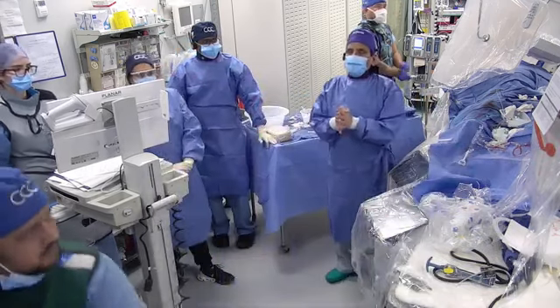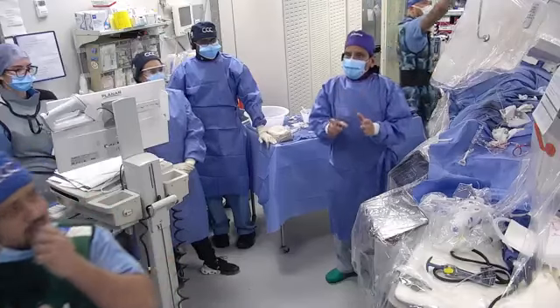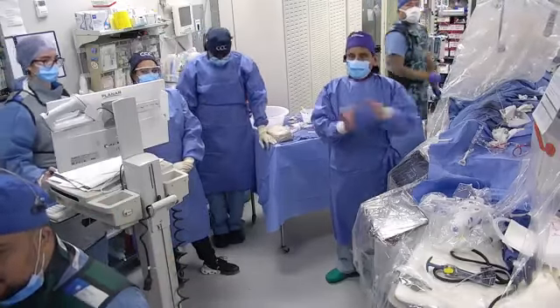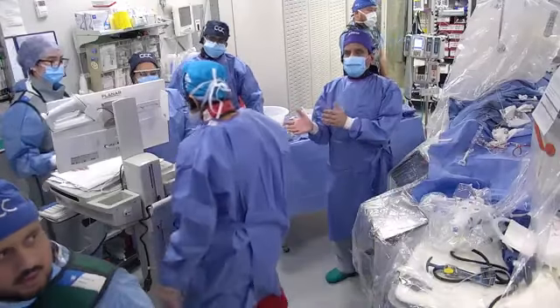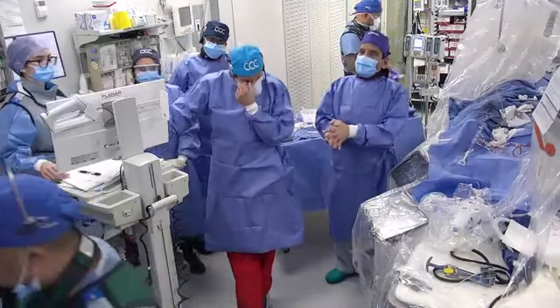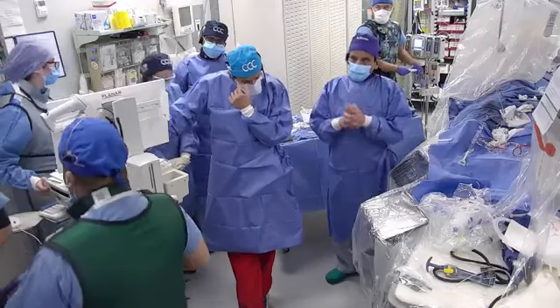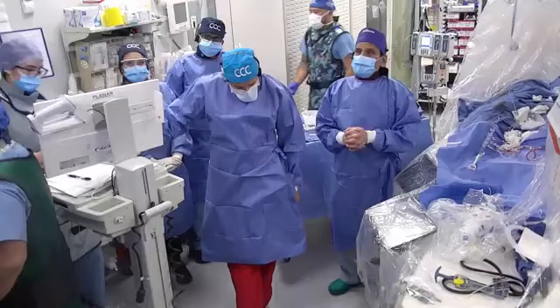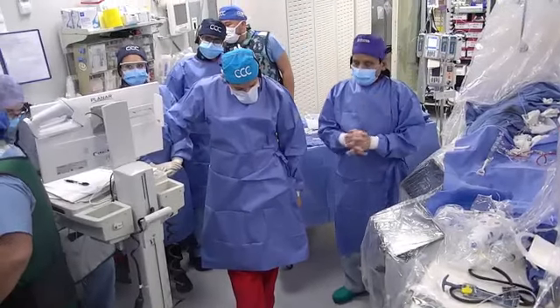But it turns out to be only one trial which showed higher slow flow compared to the competitor, none of the rota trials, only Eclipse. The slow flow occurred in 1.8% compared to less than 1% in the non-orbital atherectomy group. So the question in the past was, in a hemodynamically unstable patient, would you use rota or IVL? I would say, sorry, rota or orbital.